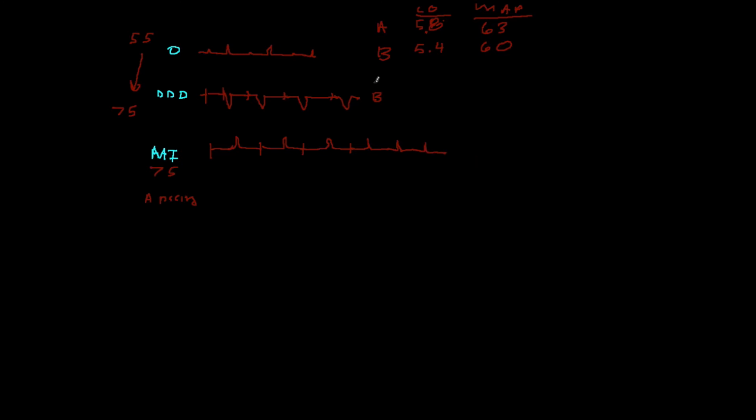Just for the sake of conversation, we'll call this scenario C. Let's say scenario C is giving you a better cardiac output and a better blood pressure. So that's probably where you want to work. You probably want to work with just increasing your atrial rate, getting anterograde conduction, letting the ventricles depolarize and contract in a very natural way, and get a better stroke volume that way. And you can play with the rate here depending on what you think the patient needs for cardiac output or blood pressure.